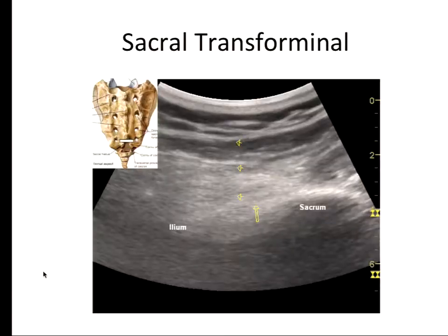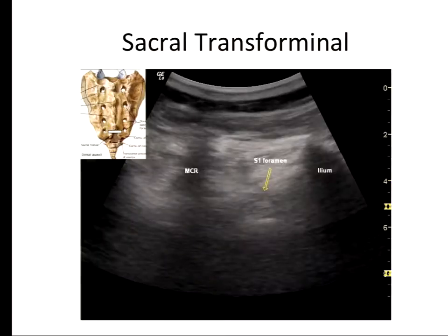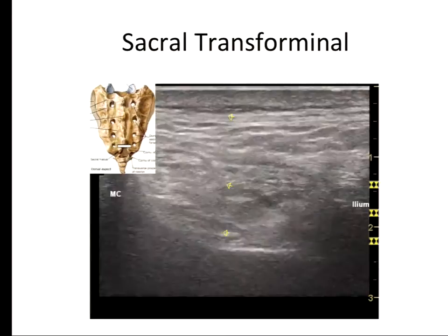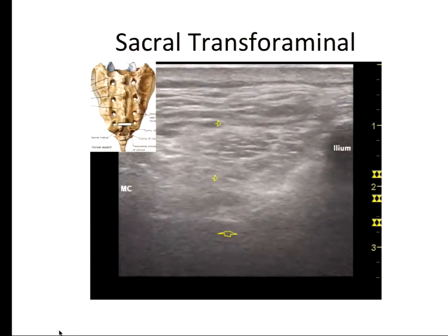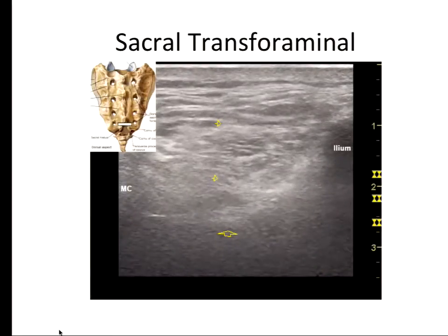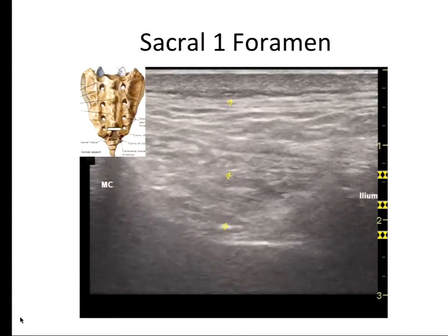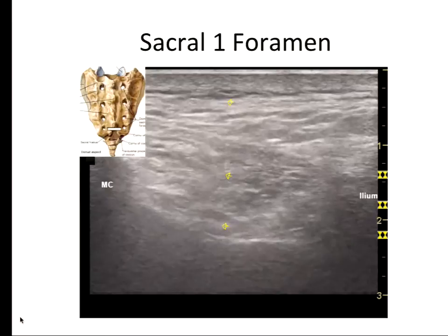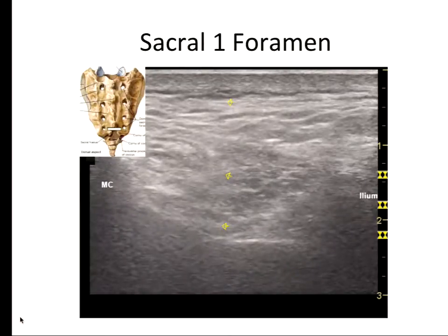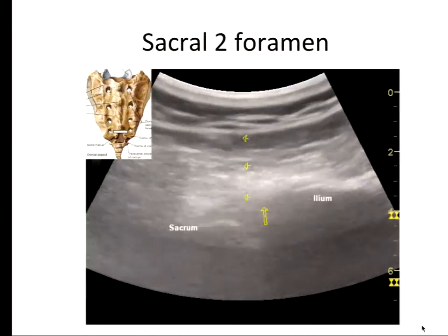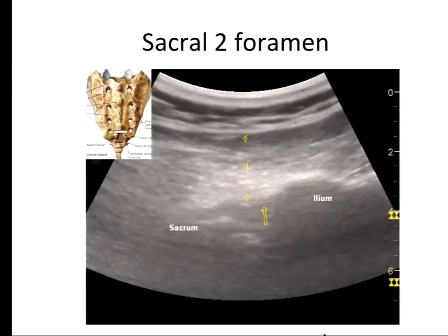I do this out of plane because it's a smaller trajectory. It's very difficult to see the 25-gauge needle, so I use an out-of-plane technique and drop the needle in. Once I'm in, I confirm it with fluoroscopy — this is the S1 foramina. The needle is introduced into the foramina; it's not very clear to visualize the needle tip, and it is even less clear to visualize the sacral foramina. But it is definitely easier to place a needle and then confirm with fluoroscopy, using tissue movement to identify where you are.